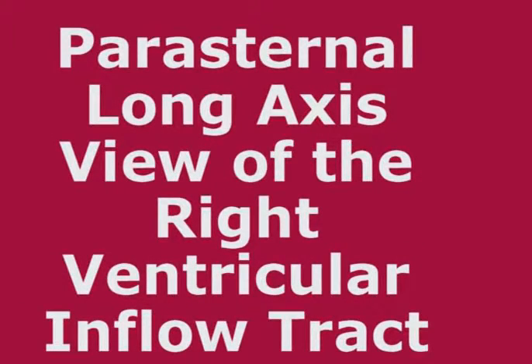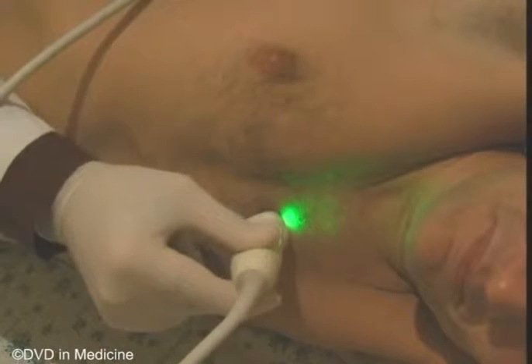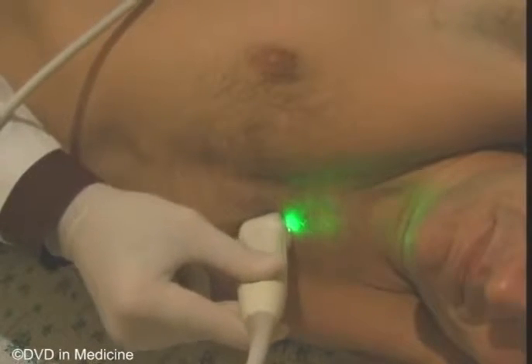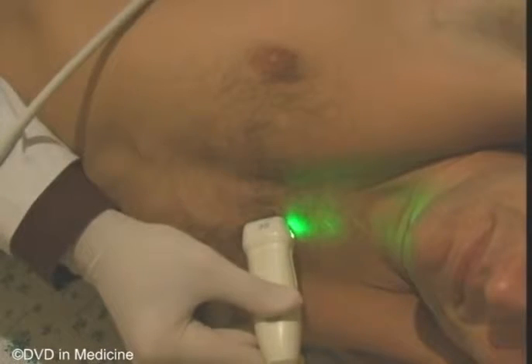Parasternal long axis view of the right ventricular inflow tract. After one has obtained the parasternal long axis view of the left ventricle, one can rotate the transducer a bit clockwise and angle it as if one is trying to look under the xiphoid process.